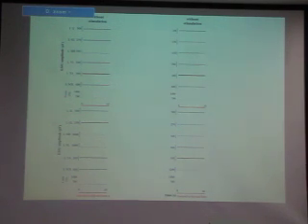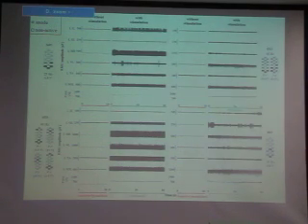Having a look at the motor pattern that allows this, we can see that without stimulation, again, there is little or no muscle activation, and they are able to achieve the upright position only because of external assistance. With stimulation, we have this overall continuous motor pattern, which can also be modulated if something happens, like a shift in body weight or a joint flexion, for example. So it is not just imposed by the stimulation, but is continuously adjusted by the sensory information. So this is, I think, the first main point.